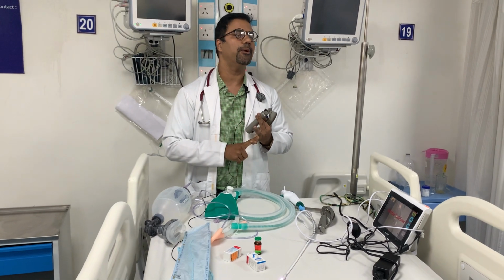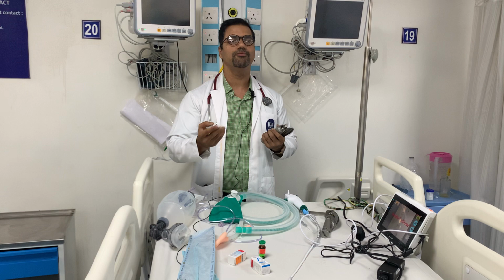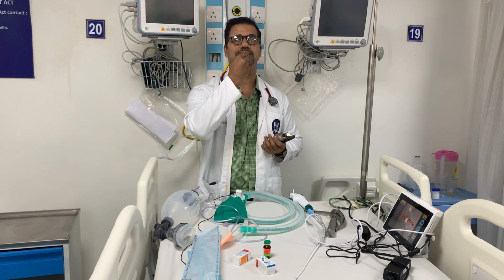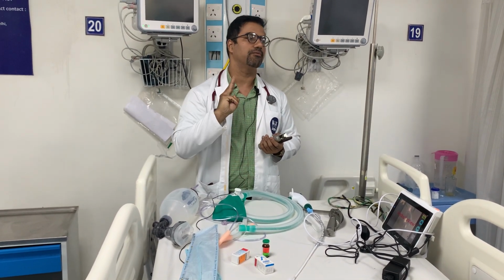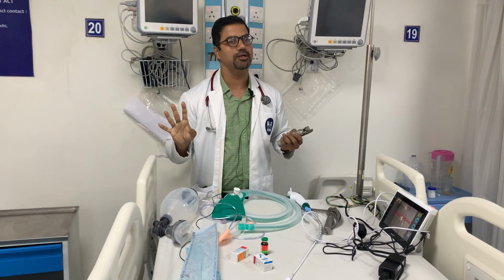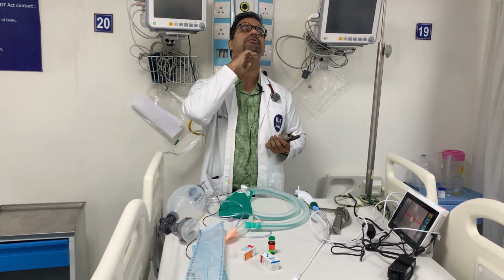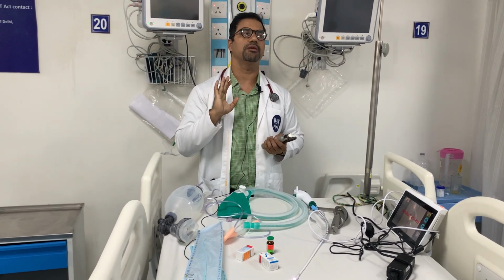The E part of LEMON is evaluate. What do you evaluate? If the patient is vocalizing, there is a formula, 3-3-2. Three fingers between your two incisors. If three fingers go in, you are safe. If fewer than three fingers go in, you are in danger, as well as the patient. The second 3 is from the mental protuberance to the hyoid bone.